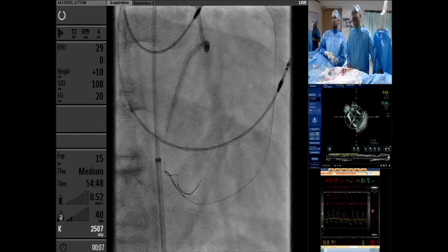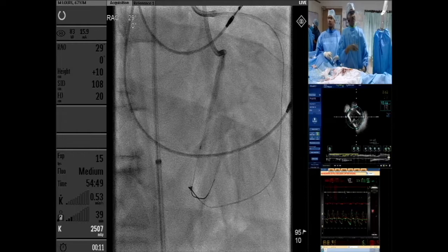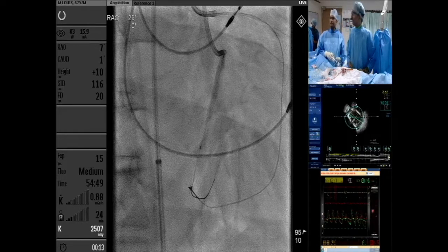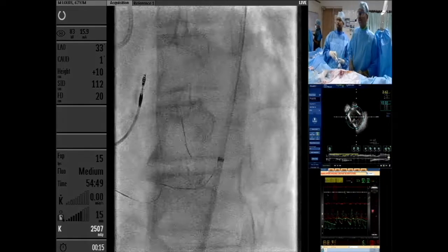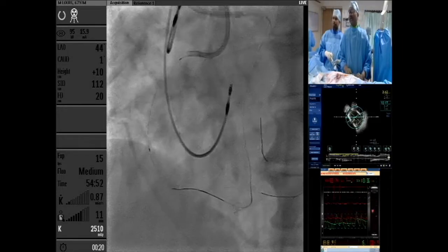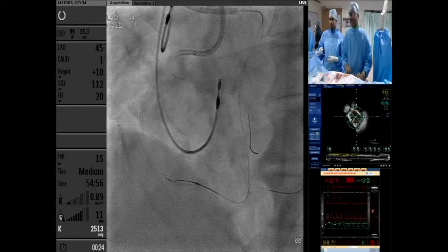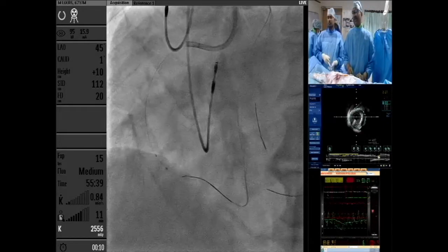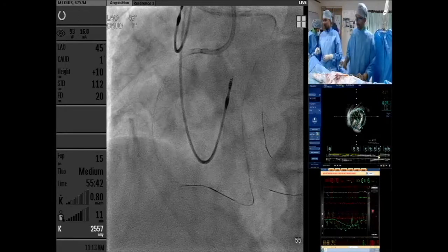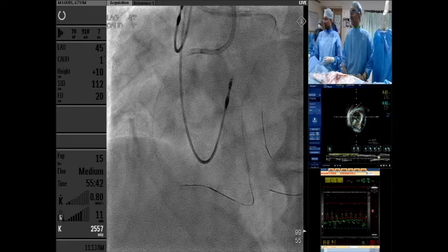Yeah, so it's well expanded. Negative. Yeah, we can go say 2.75 NC proximally. I think we can go with a 3, or okay. Right, so we'll come out with this. Out 75 NC, please. So what's the distal reference at B8, please?